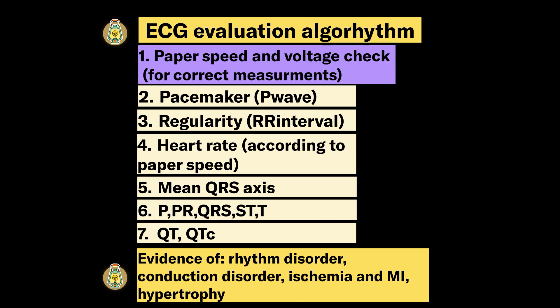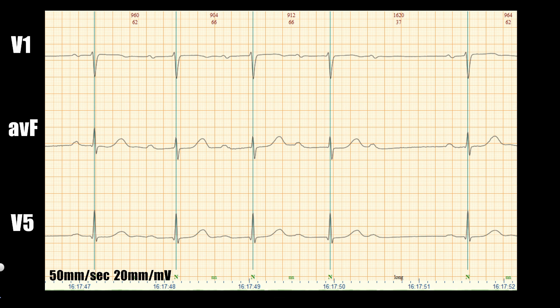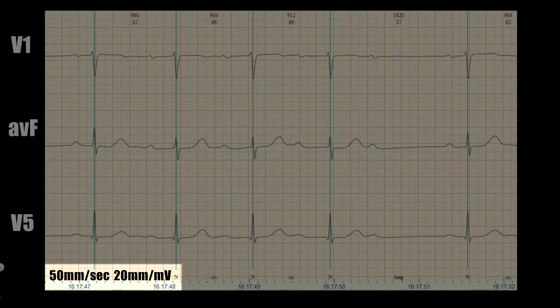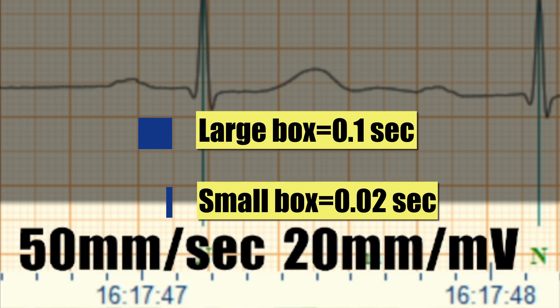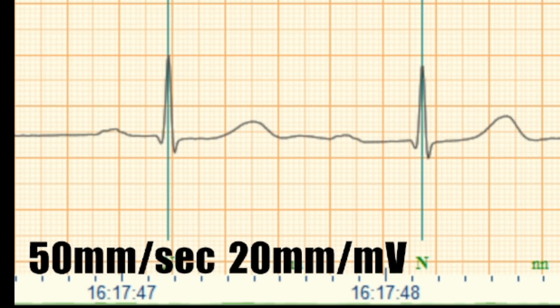We start with paper speed and voltage, which help to make correct measurements. 50 mm per second means one large box equals 0.1 second and one small box equals 0.02 second. Note that voltage is doubled — 20 mm per mV — which we will take into consideration during measurements of the amplitude of ECG waves.